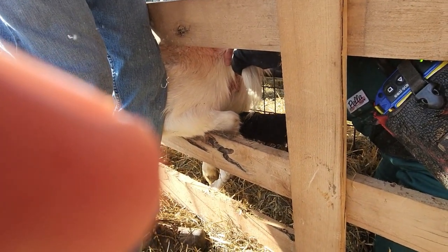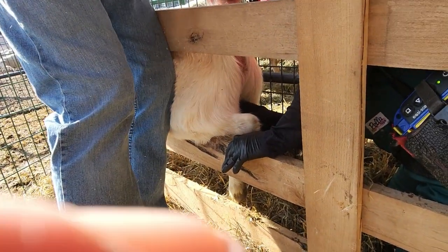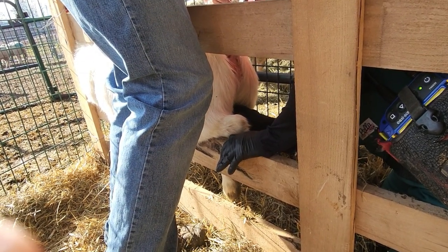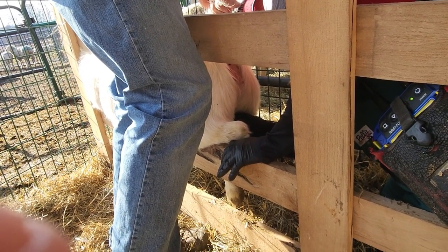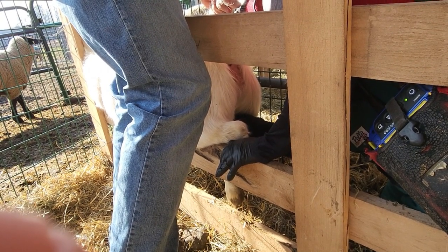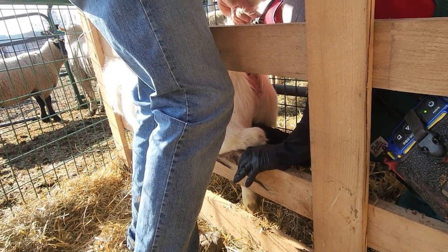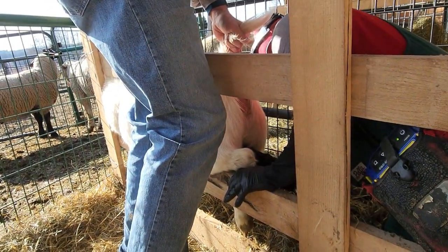Okay, are you good with pregnant or not pregnant? Or if you can tell me numbers, it'd be nice. Okay. Well, I can tell you pregnant right away. I can tell you you're probably around that. Wouldn't you let the ram in, or buck in, with these? 2nd of October. Yeah, I was going to say, you probably got 60, 70 days. I think this one got right away. Yeah, they all got 3 days. Okay, so we're really tight. So they're either going to be this or nothing. Yep. That's good to know.